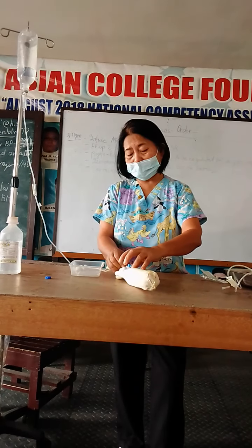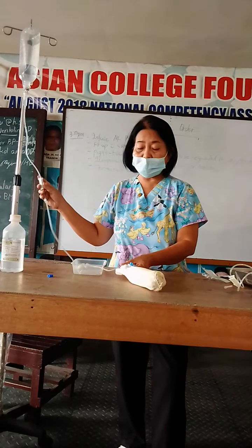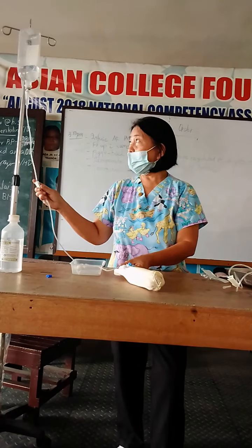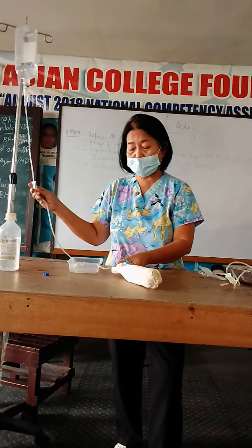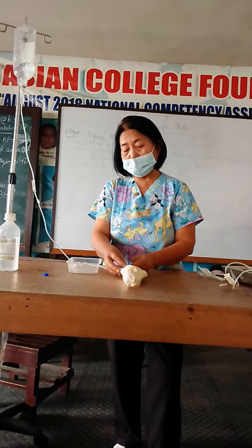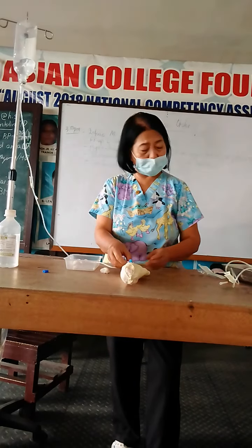Then you tighten it. Of course, after that, we're going to open the roller or the regulator. Okay? Slowly. If you close it too quickly, it will be messy. Okay. And then, before applying the plaster, you're going to remove this one and then apply plaster.